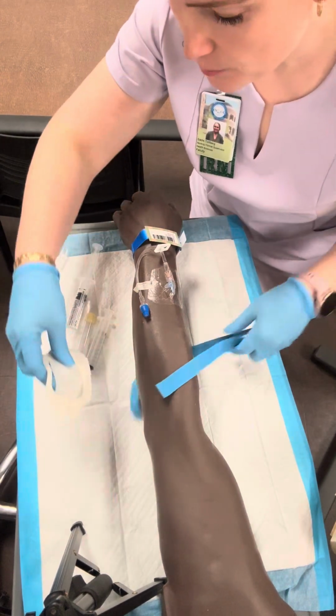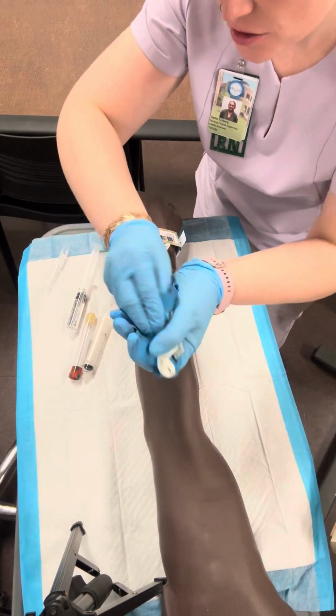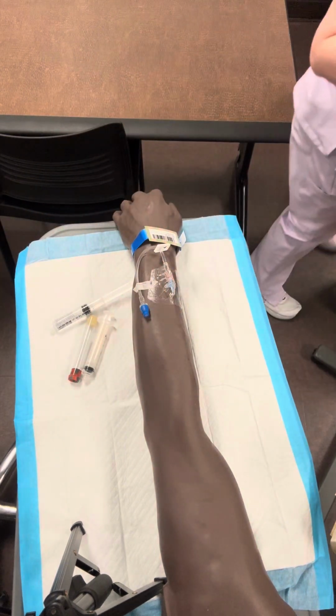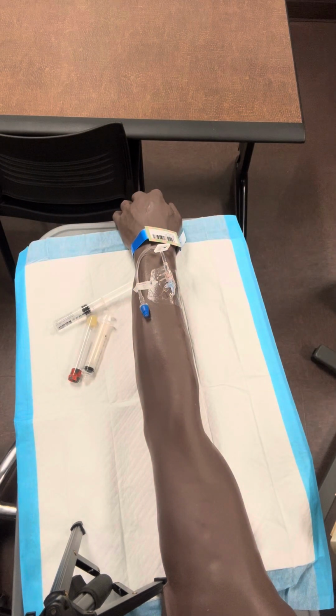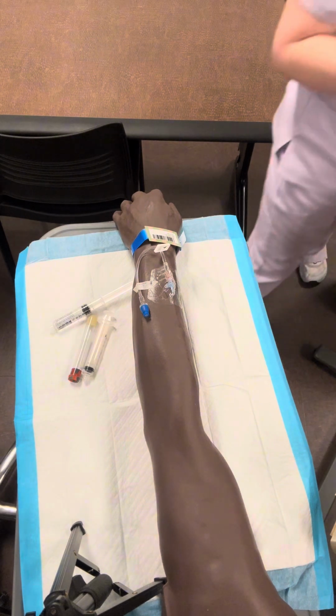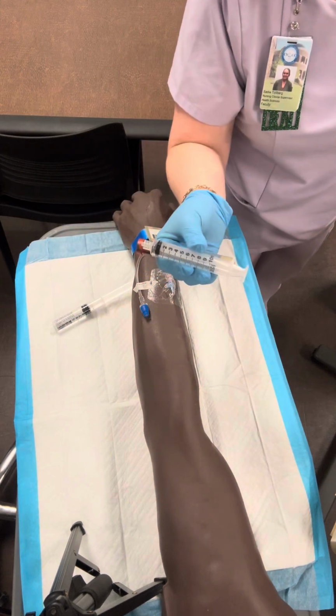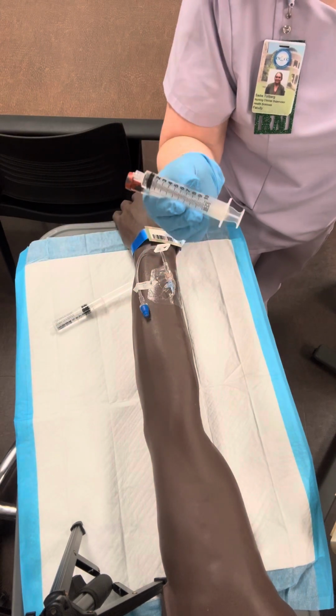Okay, going to grab my trash with one hand, my sharps with the other. My sharps container is right behind, plop. And I'm going to take my labs and my syringe and I'm going to transfer it. I'm going to label it and I'm going to send it to the lab.